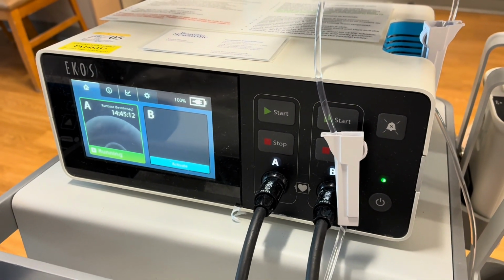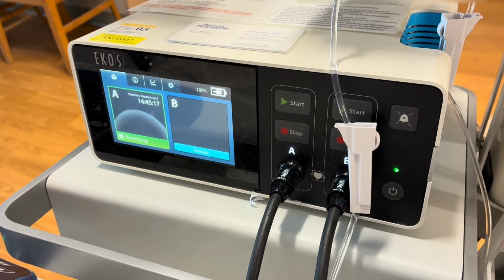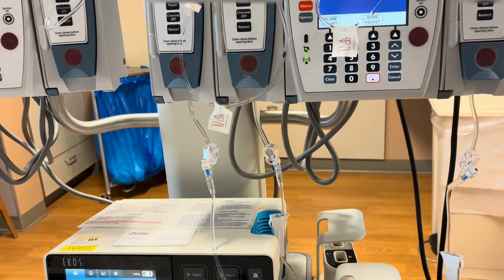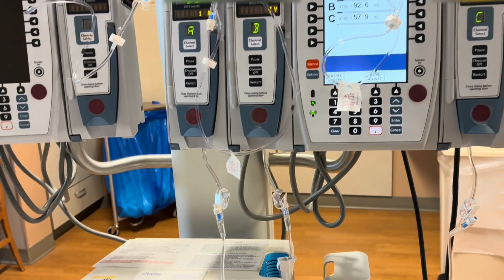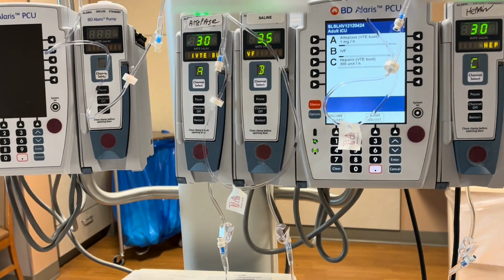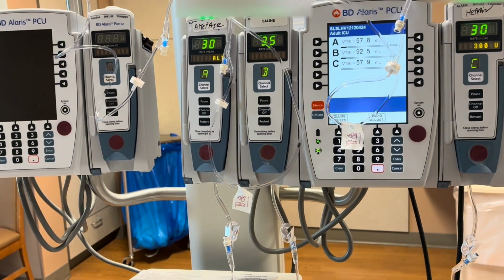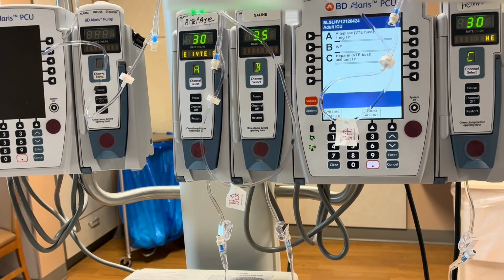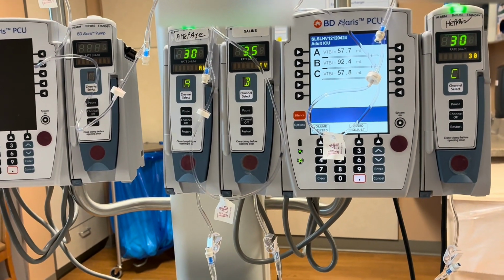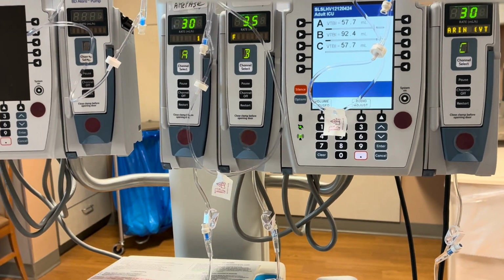So again, EKOS is a catheter-directed thrombolysis. You probably know this, but just a quick review. Your clot is a stable clot, with very good fibrin surrounding it. So they use the EKOS. It has a pulsatile mechanism that, not really breaks the clot, but helps open up the fibrin strands so that your thrombolytic, which is your Altiplace, can go in and dissolve the clot. So that's how it dissolves your thrombus.